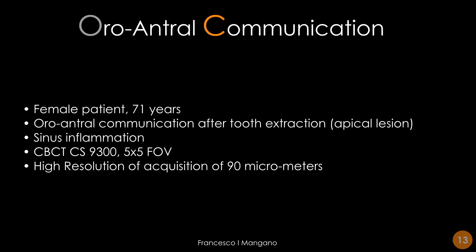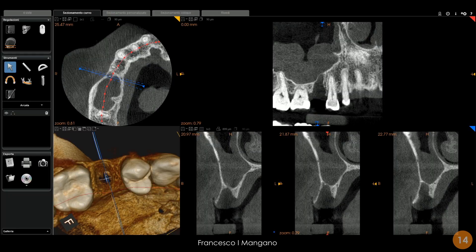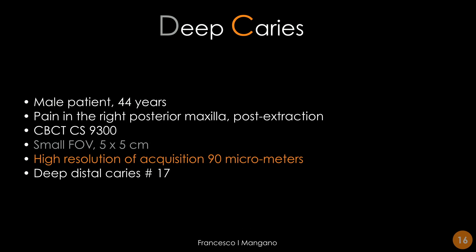Let's see a few cases in which CBCT is a very valuable diagnostic tool. For example, in this case of oro-antral communication after tooth extraction — which is fairly common — we have a CS9300 with a 5×5 cm field of view and a high resolution of 90 micrometers. We can see the quality of the image and the 3D rendering from this scan, and we can perfectly locate the oro-antral communication thanks to the reconstruction software and the different multiplanar reconstructions.